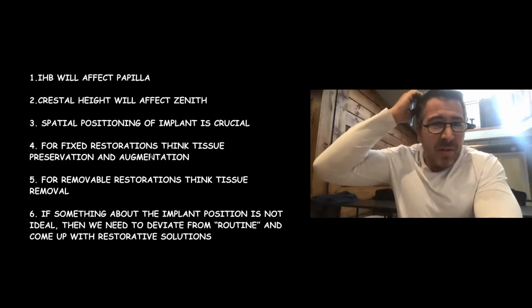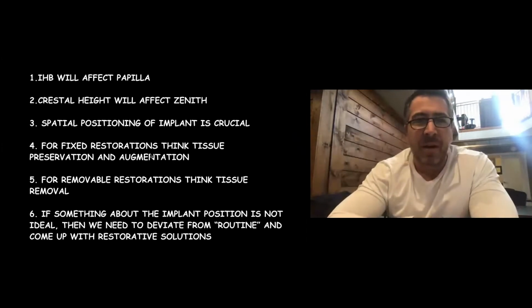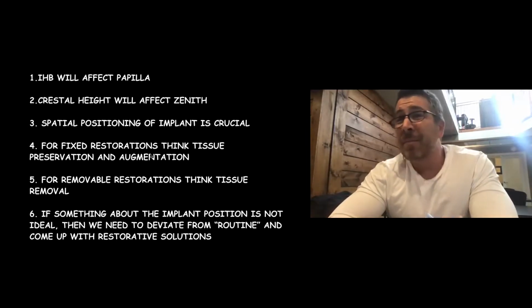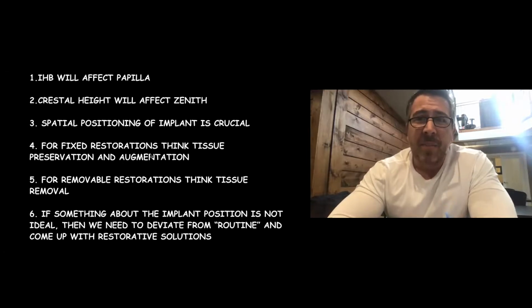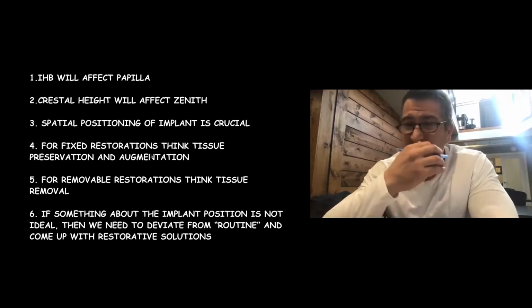And I'd be curious about two things. If there are periodontists on the forum, that comment I made about the grafting against an implant, whether or not that's something that they think is predictable, and would they rather do it in advance of the implant being there, or do they get good results after implants are already placed? And the second thing is, how many of the specialists that are in-house follow up with their implants after the restorative doc has restored them, to look at some of these parameters?